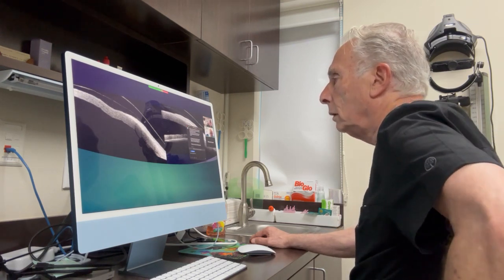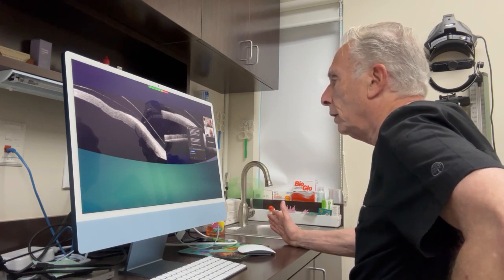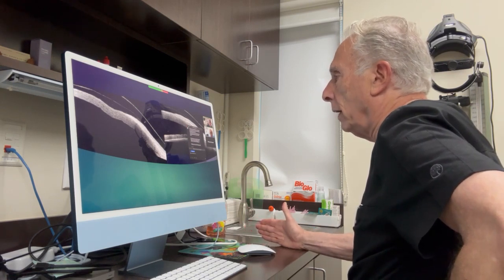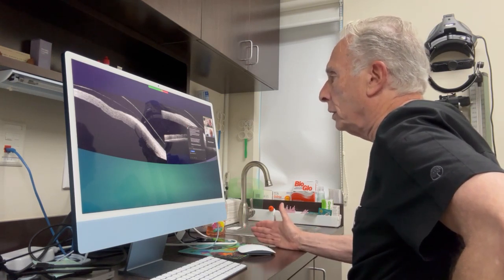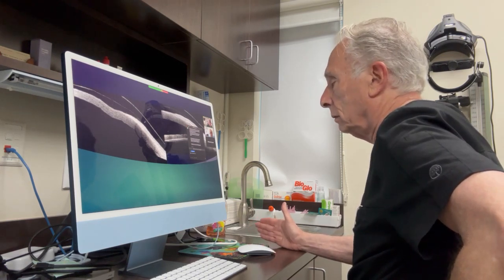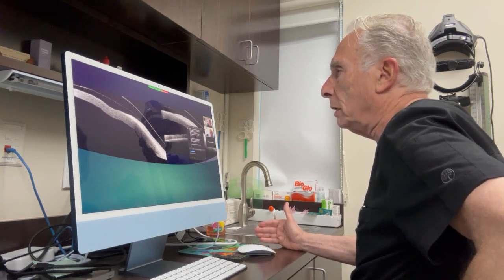If the lenses fit well and you follow the patient along, everything has a risk, but you have to take into consideration the risk-benefit ratio. And when it comes to these compromised corneas, the risk-benefit ratio is definitely going to be in favor of the patient. So as long as the patient is being watched and monitored, I don't think there's anything to be concerned about.